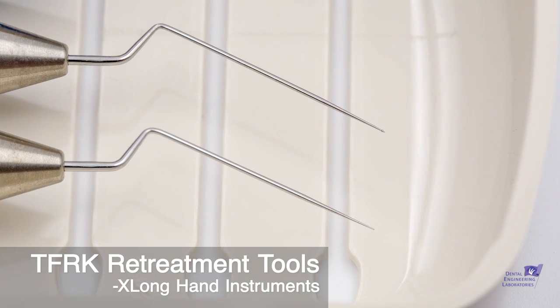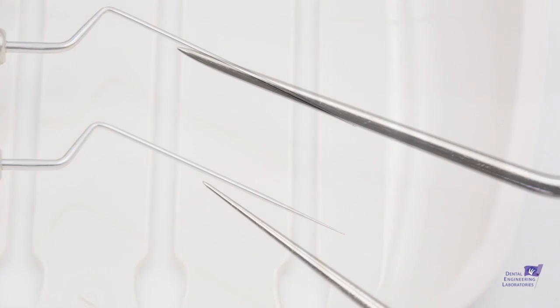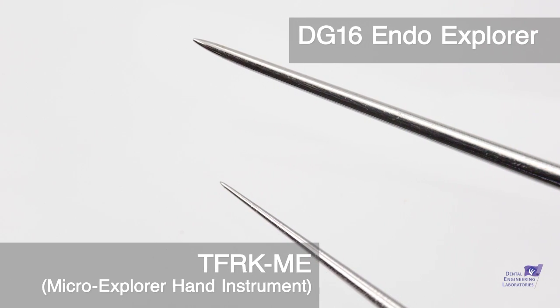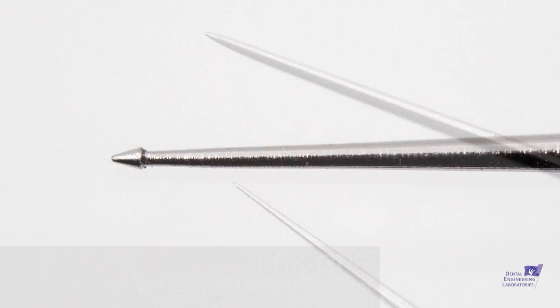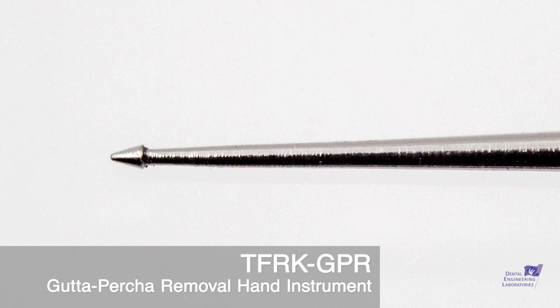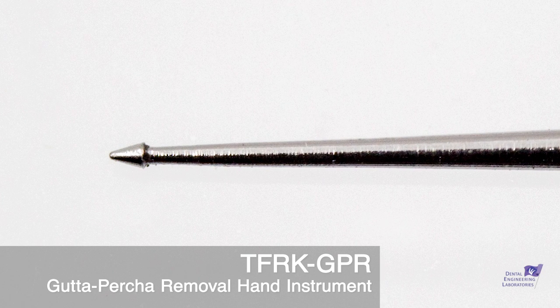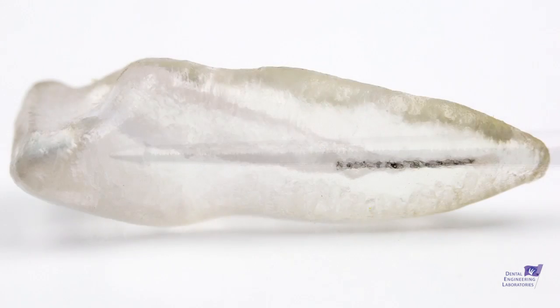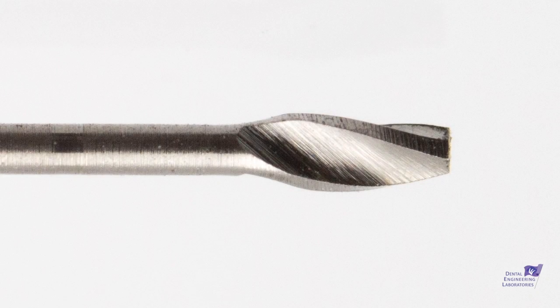Also in this underneath section are two hand instruments especially helpful for retreatments of all types. There is the ultra-fine explorer tip — these are very long tines that can go down to the cuspid. There's also a very cool gutta-percha remover that has an arrowhead on it, like a spearhead with a barb on the backside, that pulls gutta-percha out very effectively.